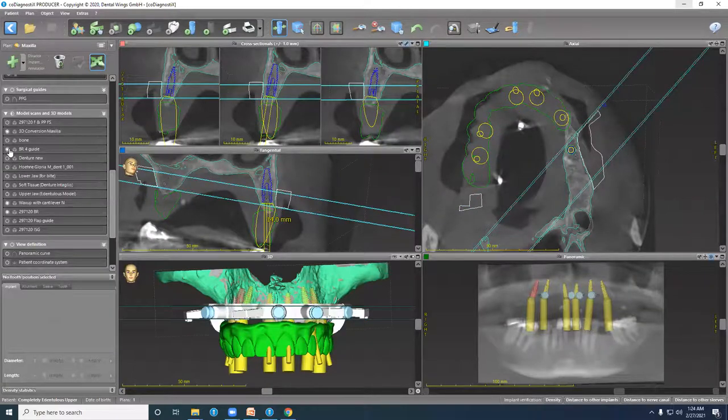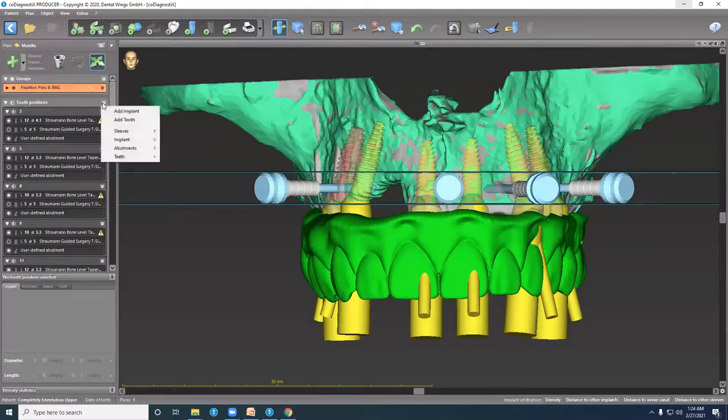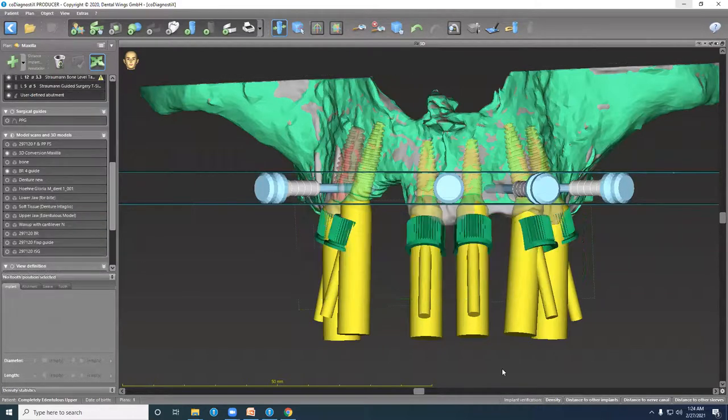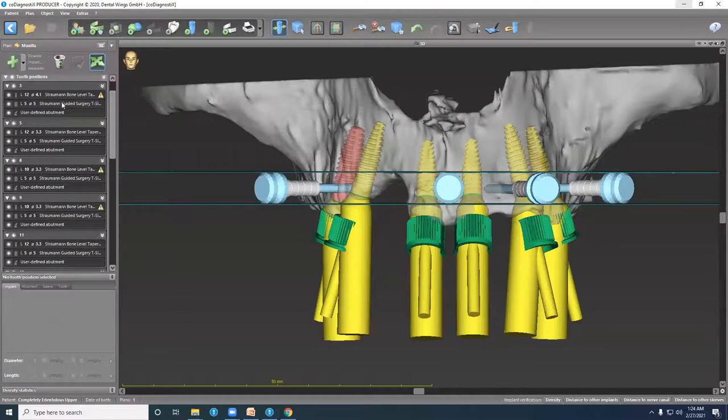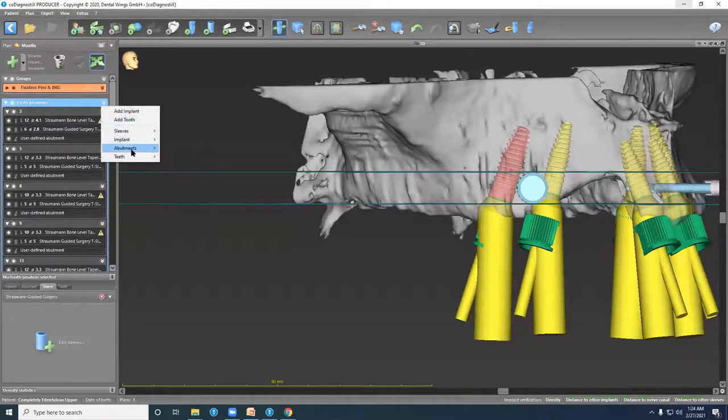Let's go back a step and have a look at the Straumann guided surgery sleeves. Since the bone will be reduced, we can use the shortest drills possible to achieve the final implant bed preparation. Let's turn on the wax up. And these are our surgical guide sleeves. Speaking about Straumann, you have three options for guided surgery. You can proceed with a pilot drill guide compatible with a 2.2 pilot drill, or a 2.8 pilot drill. As we notice here, the sleeve changes according to the diameter selected.